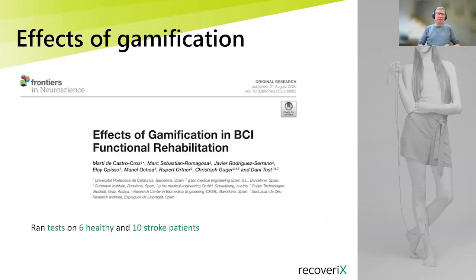We also investigated the effects of this gamification in the rehabilitation. So what we did is we ran tests on 6 healthy subjects, but also 10 stroke patients, and compared the standard RecoverX avatar to the game.